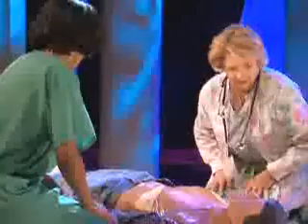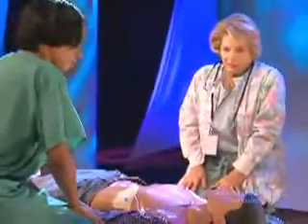With 2 rescuers, don't stop CPR until the AED pads are attached to the chest and you are ready to let the AED analyze the victim's heart rhythm. Plug in pad's connector next to flashing light. The AED is now ready to check the victim's heart rhythm.